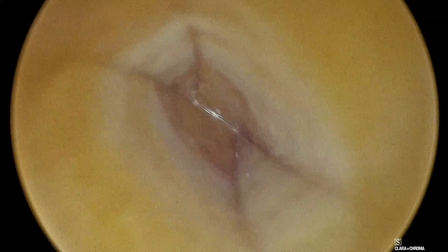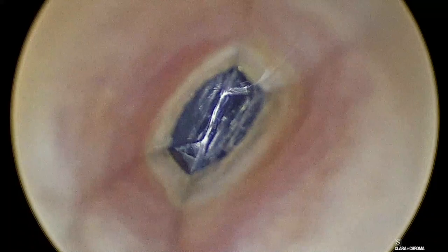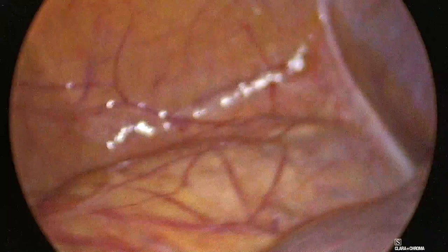From here, we just go in looking at the fascial layers. Since we access the cavity with the Veress needle, I think it's very important to go in under vision and not blindly. So you see here, there's the fascia, the muscle. We are expecting to see some fat, and then the peritoneum, and we're in. And you see that the liver is right in here. So we are right on top of the liver, as we were expecting. Kidney is there, and then we have the colon, and down there, the bladder.